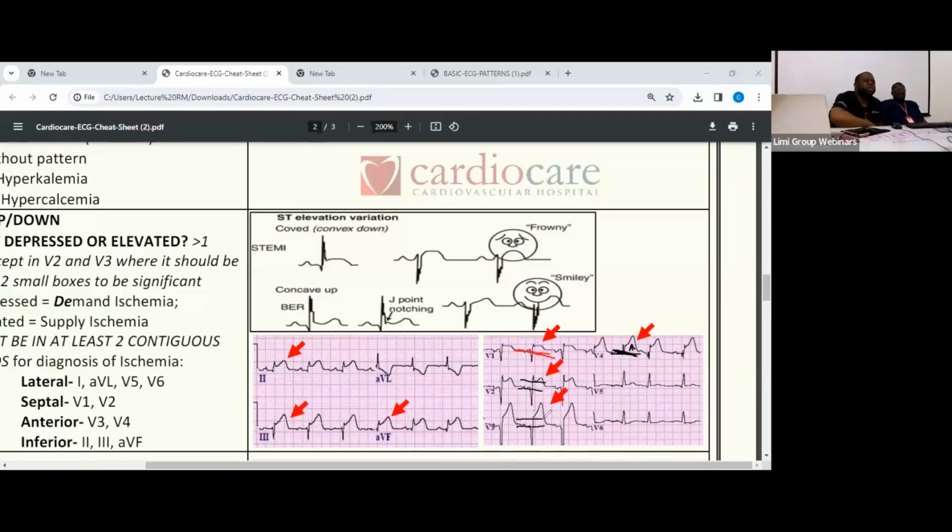Sometimes, unfortunately, somebody has been treated for ulcer, and we see this one. Patients die from this thing. Heart attack is deadly. And we can see in this one now, we can see it again. Now, the trick about this is don't use only one beat to say it, and don't use only one lead.